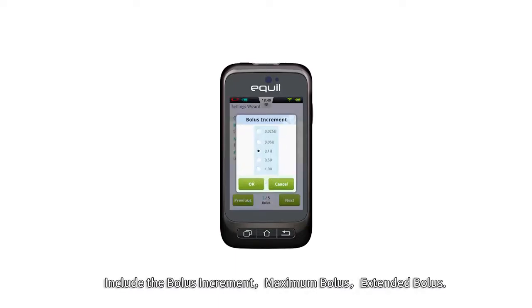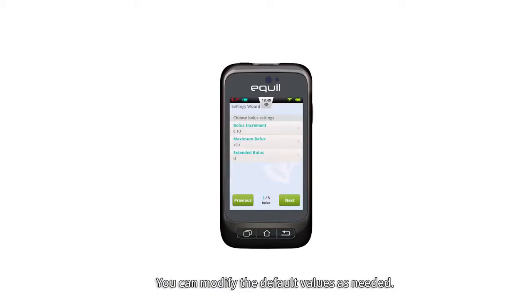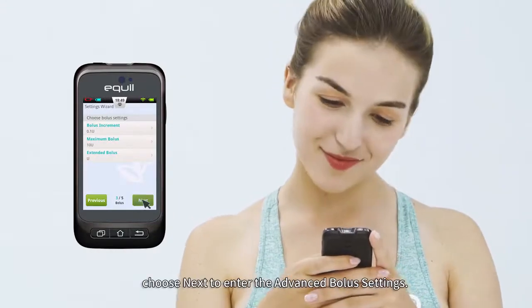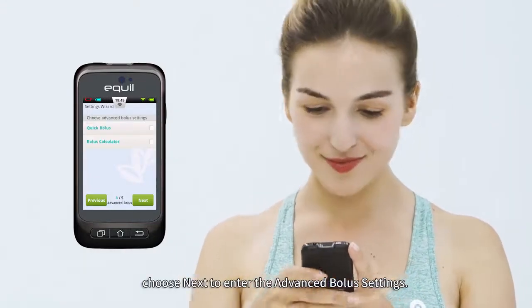Include the bolus increment, maximum bolus, extended bolus. You can modify the default values as needed. After finished, choose Next to enter the advanced bolus settings.